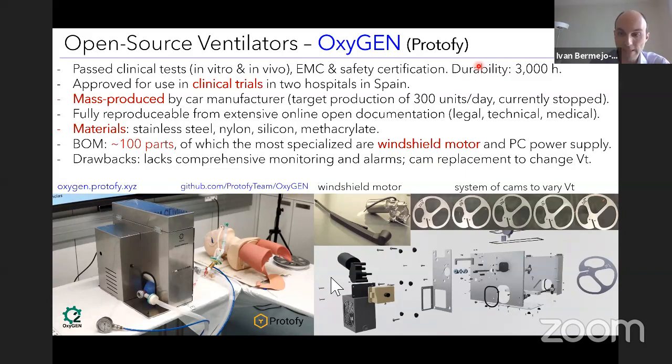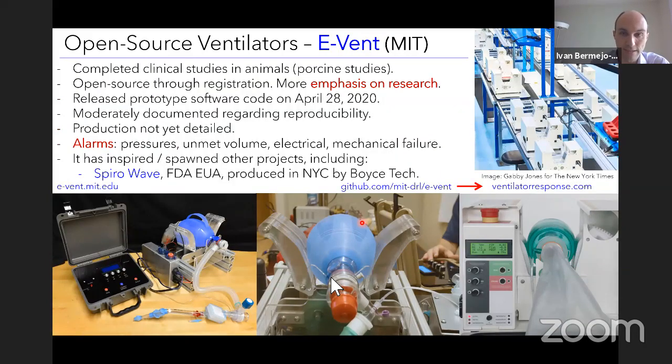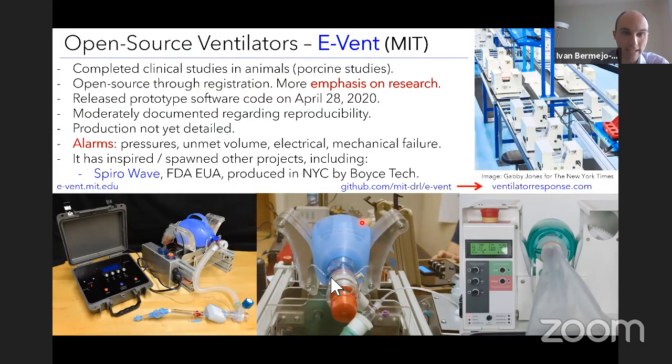So it is a quite promising design. It actually started several years ago as a student project at MIT, and now they have continued that through the COVID-19 pandemic.